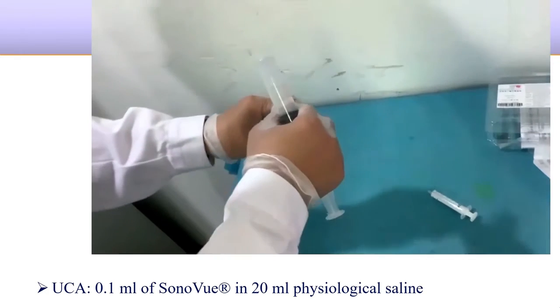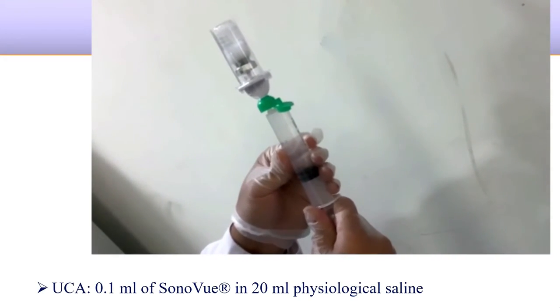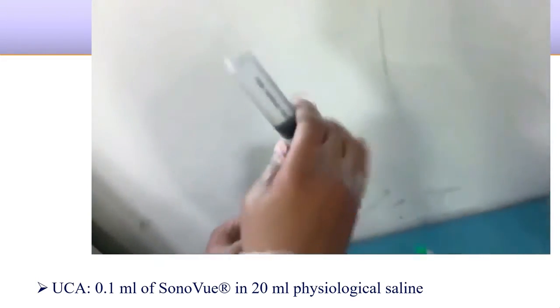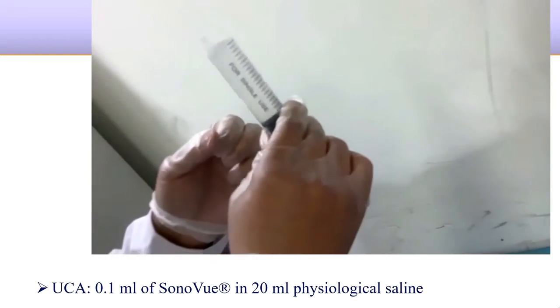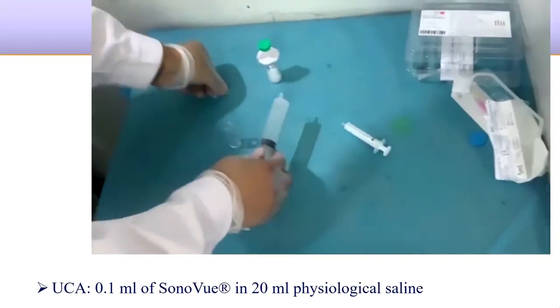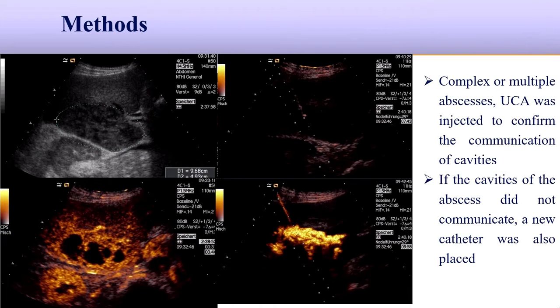To make the contrast agents, we take 0.1 milliliter of SonoVue in 20 milliliters of physiological saline. This is the video of how we make the contrast agents. Usually we just take a few drops of SonoVue. Firstly, we perform the intravascular contrast enhanced ultrasound to show the structure of the liver abscess. And then we insert a needle into the abscess.